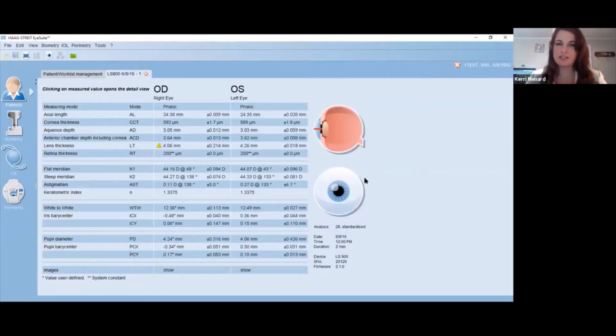And the second question, Kirsten, what was that? Oh, can dense cataract mode be turned on and off? You cannot turn it on and off. It will automatically kick in based on the strength of those signal scans. But if you are questioning the dense cataract mode measurement, you could theoretically delete the composite value and try to rescan.